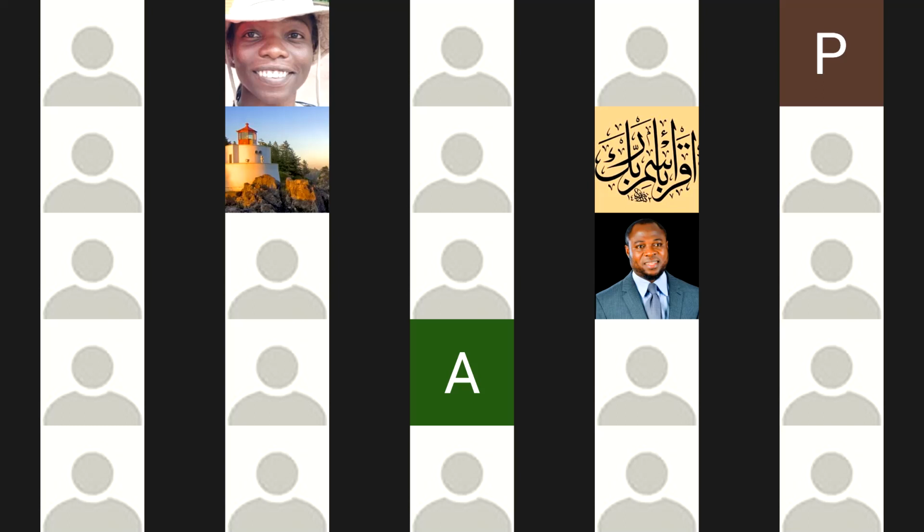But very experienced otologists would be able to know exactly where the anatomy is. So I can do it on a lesser quality scope, but if it's more than a myringoplasty, you need to be a good otologist. The blood is just frustrating, and then the beauty of the endoscope is taken away. So myringoplasty, any scope, but middle ear surgery, cholesteatoma, you need the best you can get.